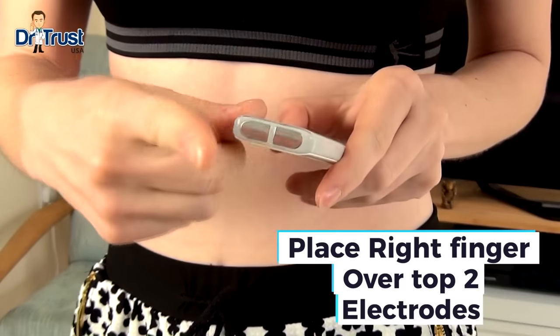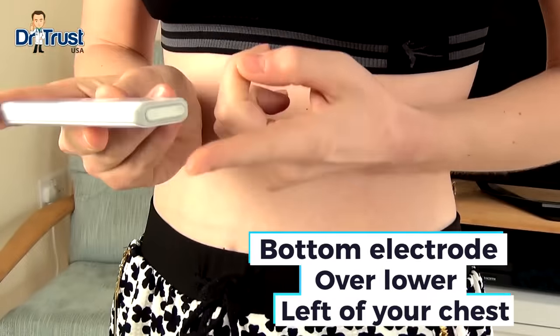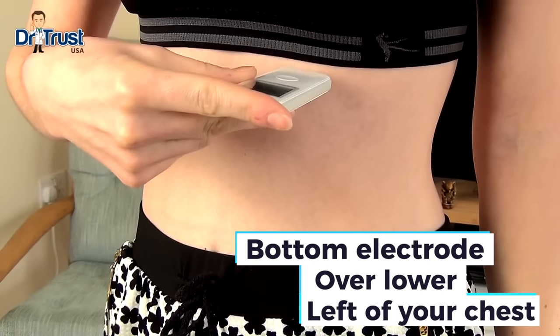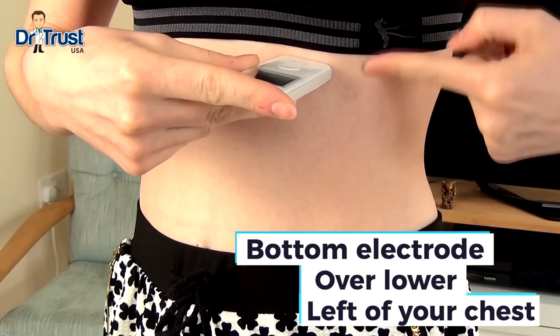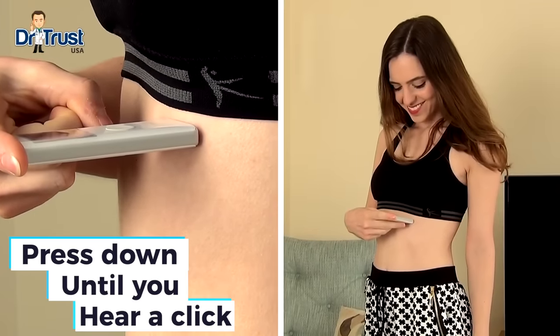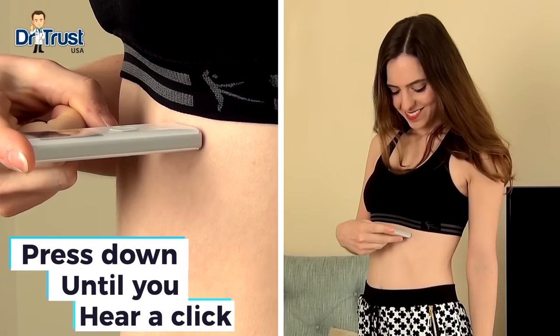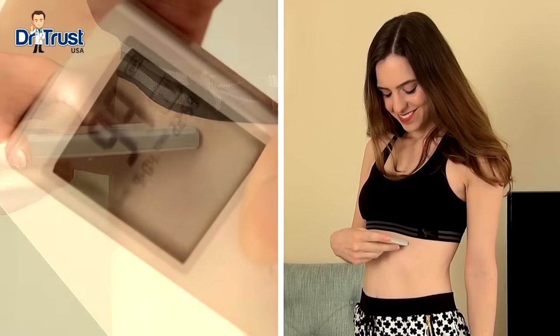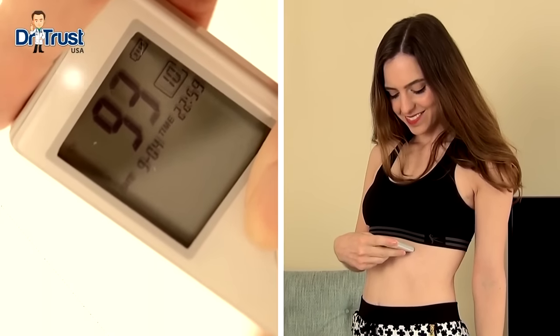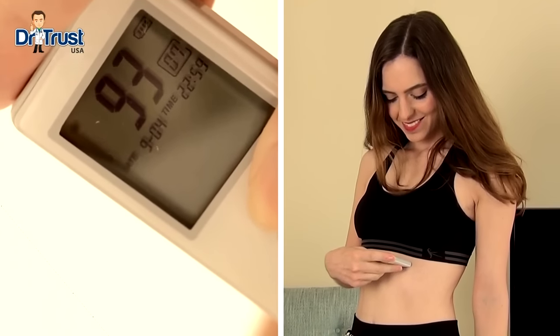To take a reading, lay your right finger over the top two electrodes and place the bottom electrode in contact with the lower left of your chest, around 10 cm up from your last rib. Press down until you hear a click, making sure your hand is not touching your chest and your left hand is not touching your right hand. Stay still and breathe normally. The device will beep when the measurement begins. Keep the device in place until the measurement is complete.